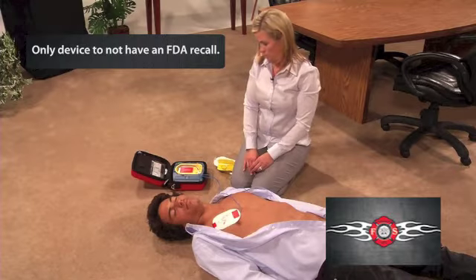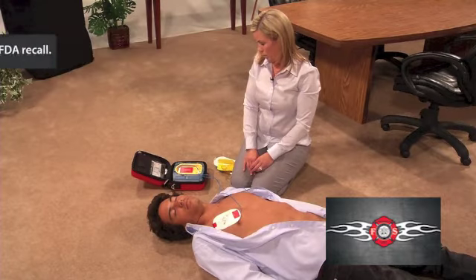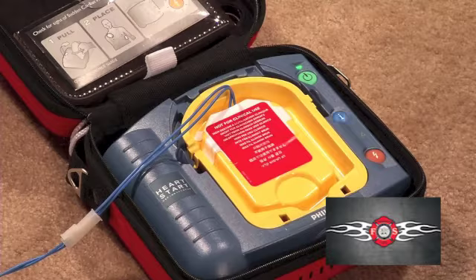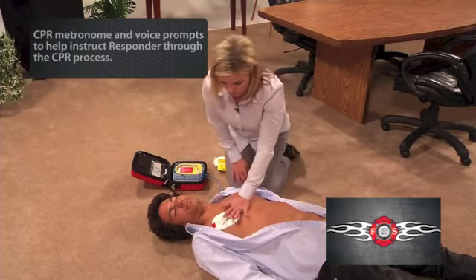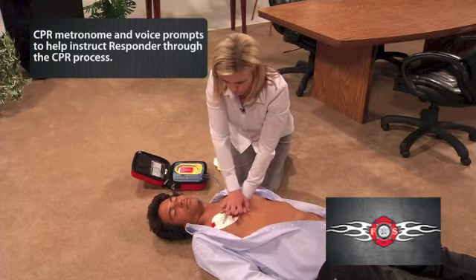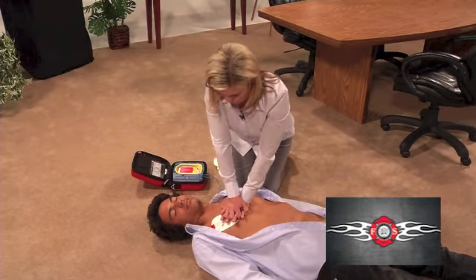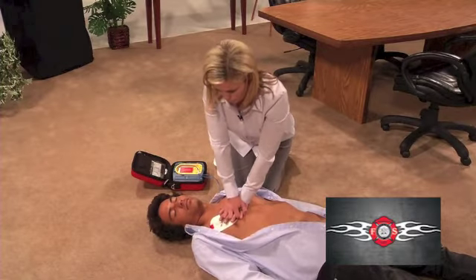Be sure emergency medical services have been called. It is safe to touch the patient. Begin CPR. For help with CPR, press the flashing blue button. Place the heel of one hand in the center of the chest, between the nipples. Place your other hand on top of the first. Push the chest down firmly 2 inches. Keep time with the beat.